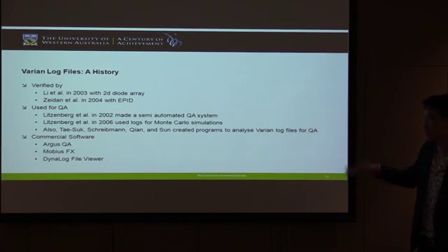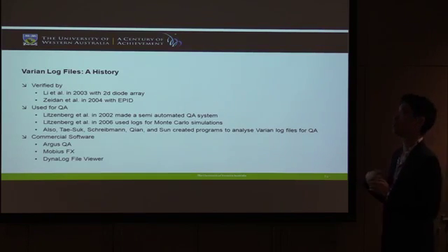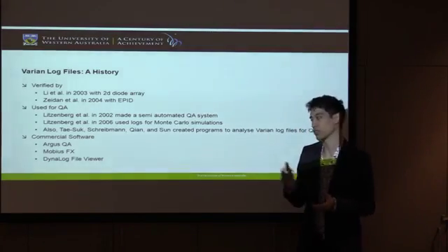And in 2006, they were also used for Monte Carlo simulations, but they were only used to find if the beam was delivering radiation or not at each time step. If it was, then they just fired an electron through.